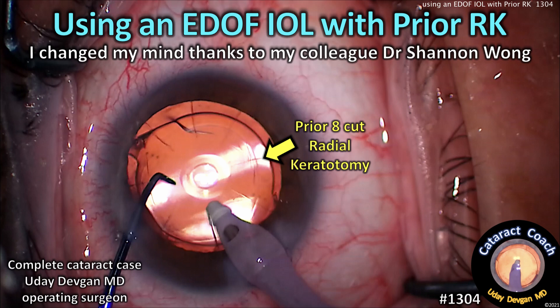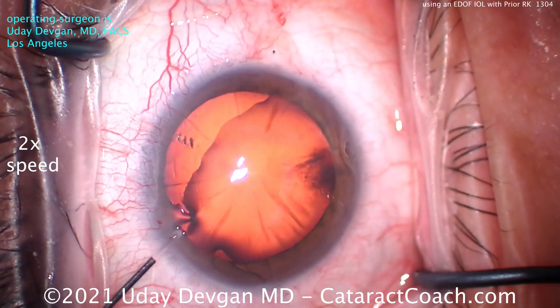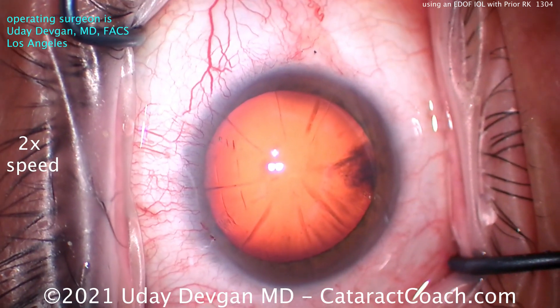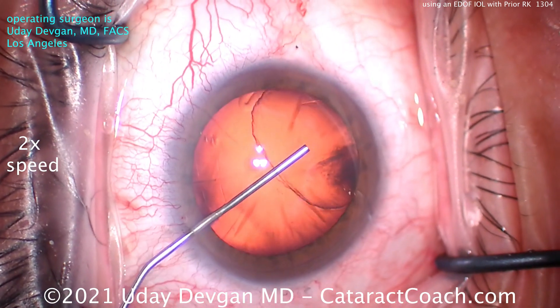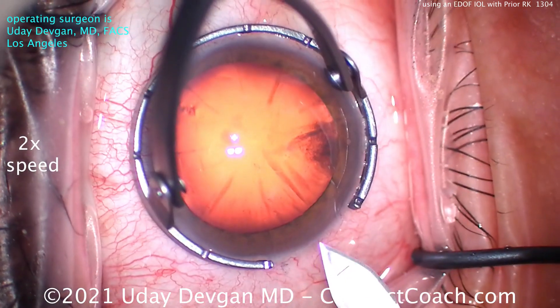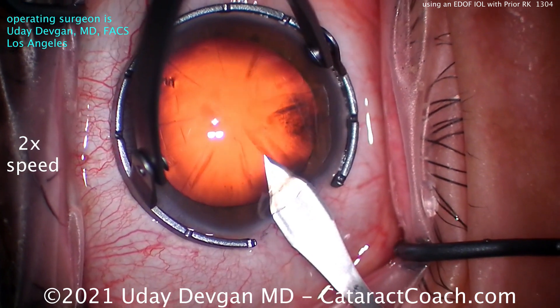I've changed my mind here. I like to watch YouTube videos the same way that you do, and I learn from colleagues. I was recently watching a video from Shannon Wong, a well-known ophthalmologist in Austin, Texas, and a close friend and colleague. He's an advocate of using extended depth of focus IOLs in patients with prior RK.